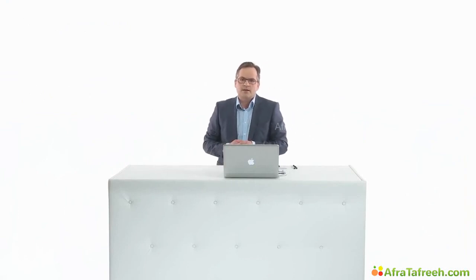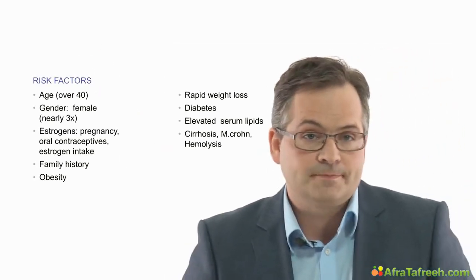Gallstones are the most common disease of the gallbladder and occur in about 6 to 10% of all humans. Statistics tell us sonography detects gallstones in over 15% of patients older than 60 years in the US. Stones in the gallbladder will reflect the sonic waves and produce an echo there, so that the gallbladder does not appear totally black. And we are going to search for them.